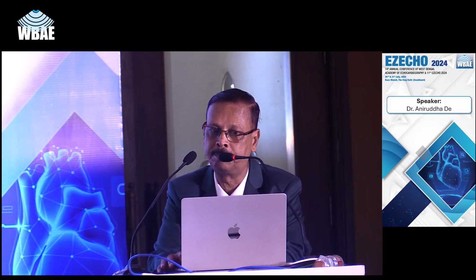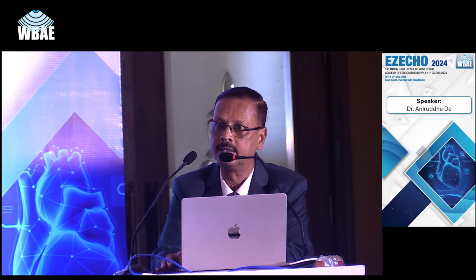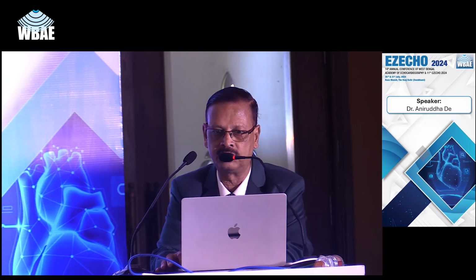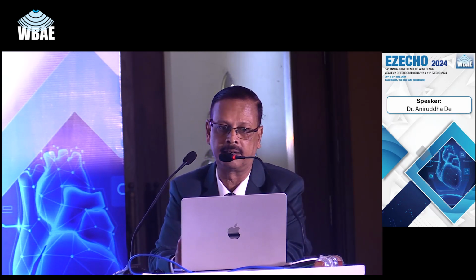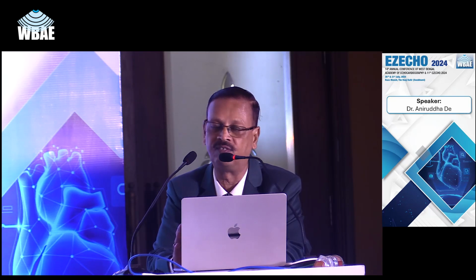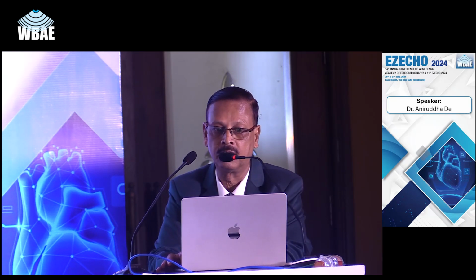And next is the TR velocity. If it is more than 2, you take the TR velocity here, and by the way, there is some variability, so you can average it. The first is illustrated by measuring the maximum tricuspid regurgitant velocity, a good determinant of the filling pressure increase when more than 2.8 meters per second.